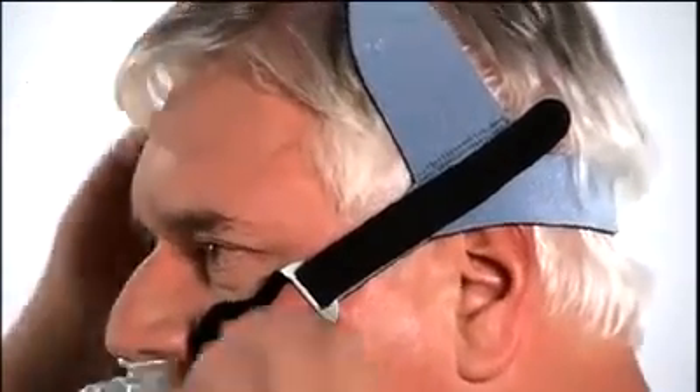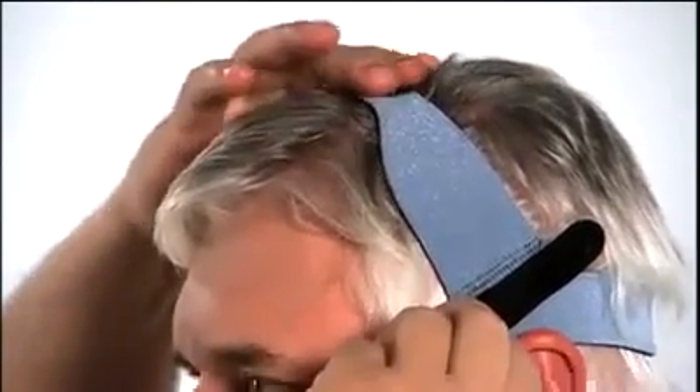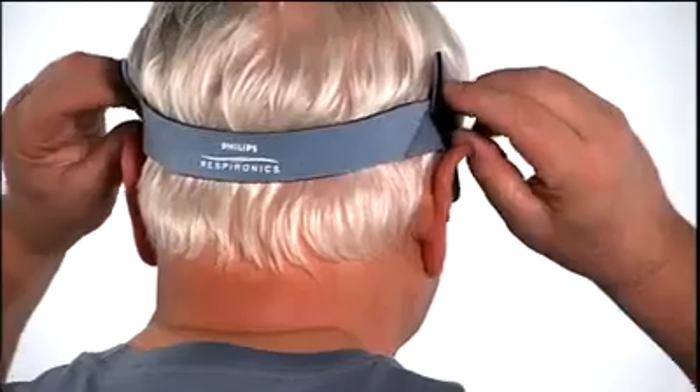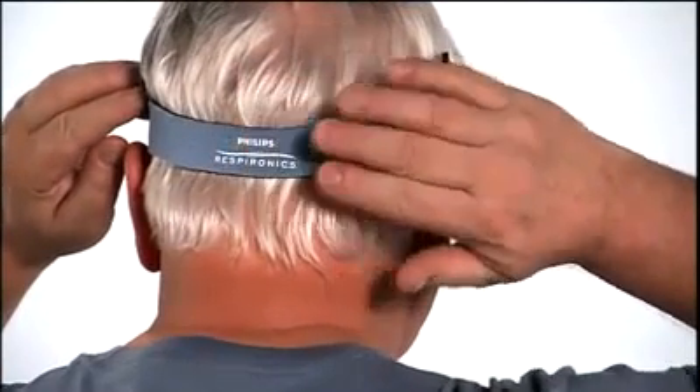If the side straps are on your ears, tighten the top strap slightly. There should be no gap between the top of your ears and the side headgear straps. The back strap should be positioned at the base of your head.